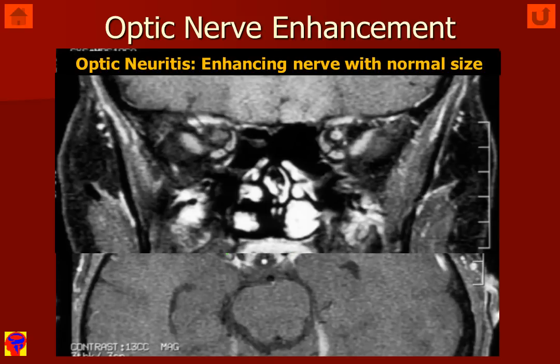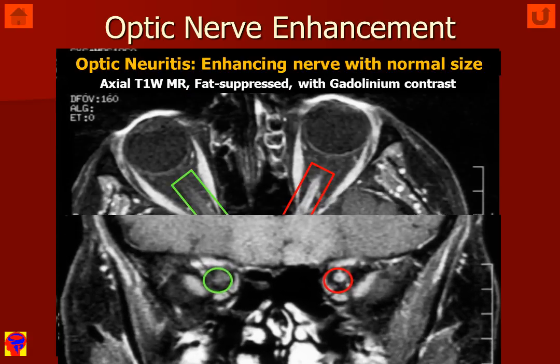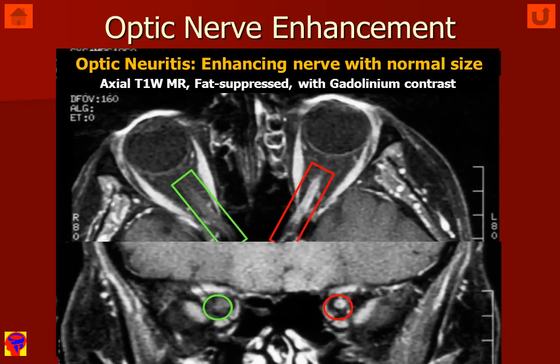If we look at the coronal images from the same patient, we can see inside the green circle the normal optic nerve without contrast enhancement, and on the patient's left orbit inside the red circle we can see abnormal enhancement of the optic nerve, which is nonetheless not enlarged. Abnormal enhancement of the optic nerve without enlargement is most consistent with an optic neuritis.